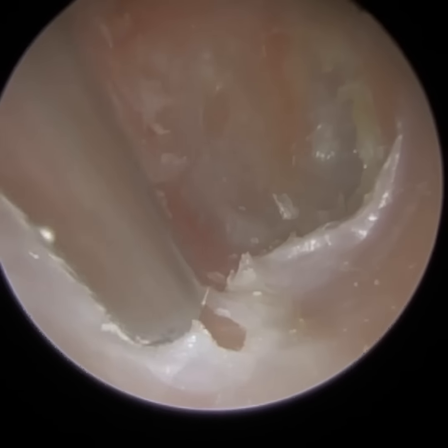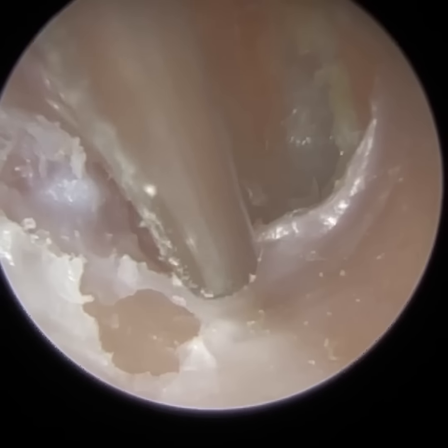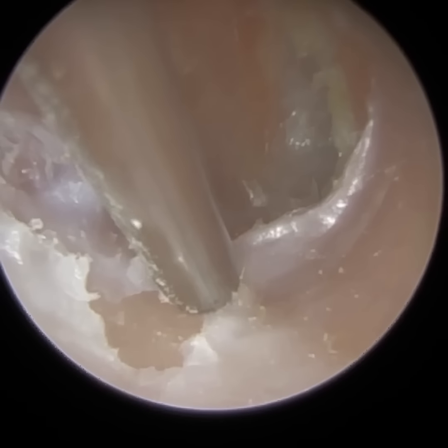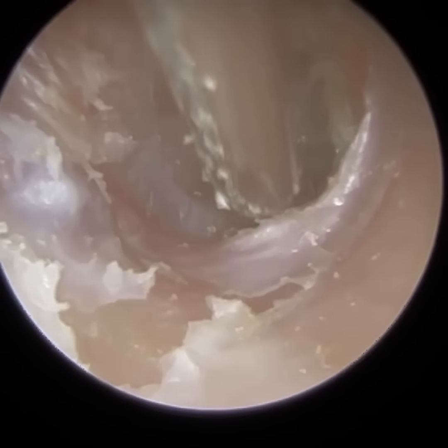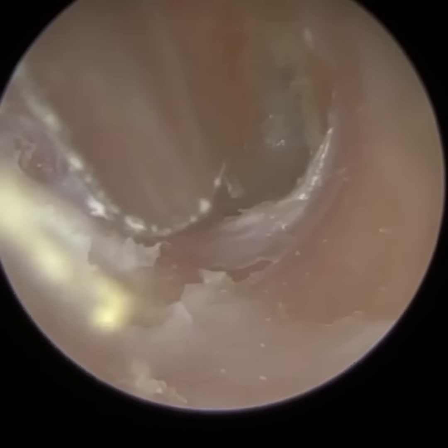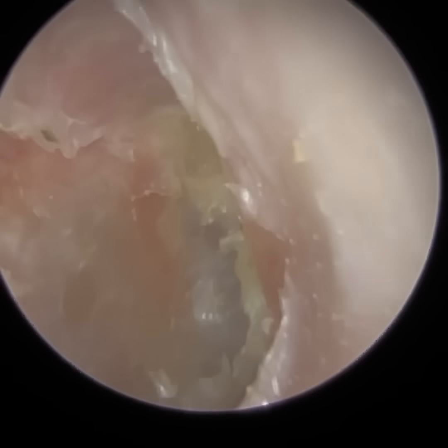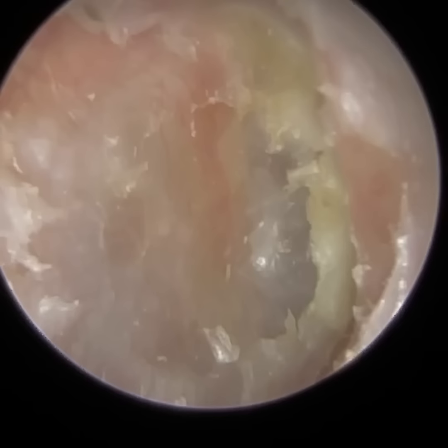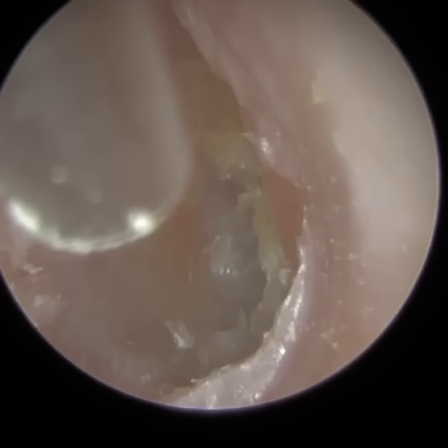And as I'm peeling this, I'm just hoping all of it will peel, but as you can see, it's not. It's separating in little pieces. So I think in a moment you're going to see me bend, angle, curl the fine end, whichever you wish to call it.